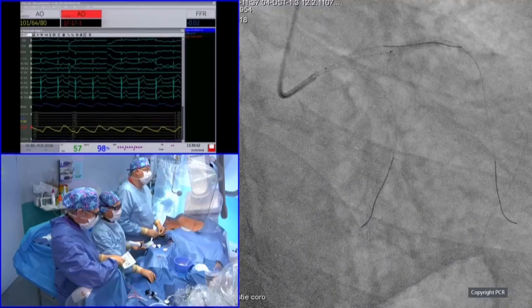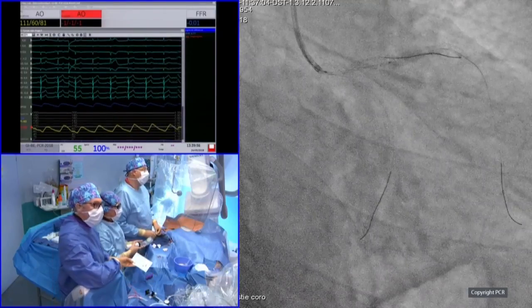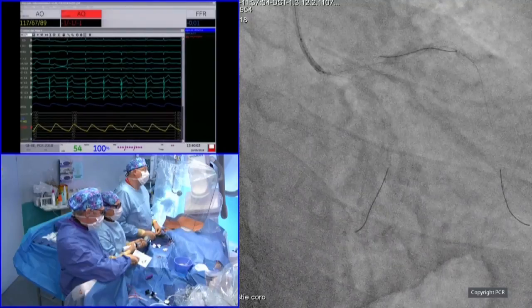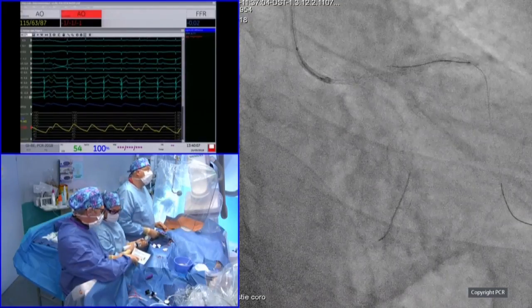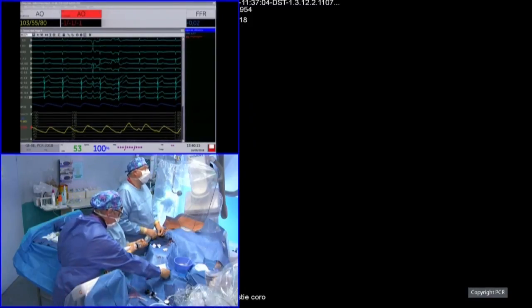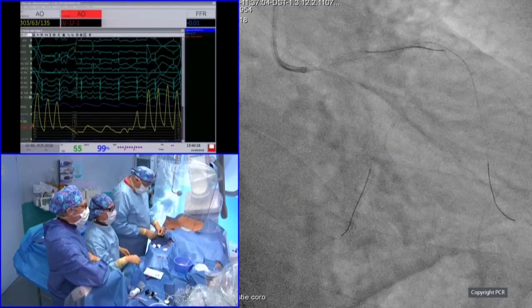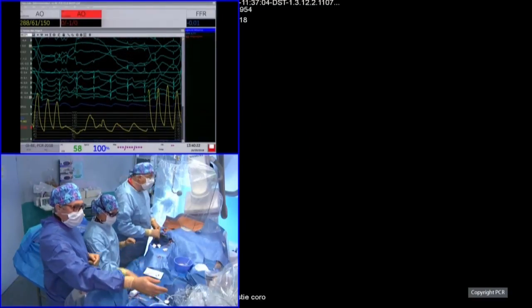So very important is to know the characteristics of the balloon that you are using when you deploy the stent. So the stent is nominal at 9. So the 3.5 at we went to 12 is 3.6. Yes. So I try to avoid crushing this stent by longitudinal compression when removing the balloon. So now we can have the POT balloon.